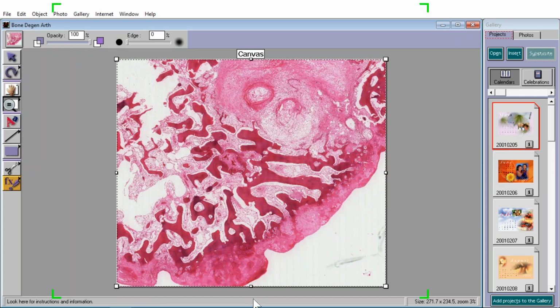Look how it's real thin here. It's a little thicker here. It looks like there's almost nothing here. So this is a situation, the classical definition of a degenerative disease, in which you have a loss of normal number of uniform cartilage cells. This is the earliest change that you see in degenerative arthritis.